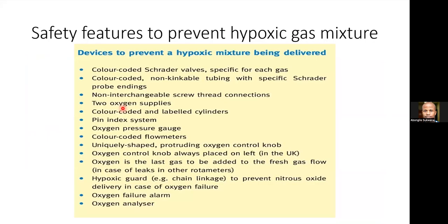Okay, and then these are some of the safety features to prevent giving a hypoxic gas mixture when you're ventilating a patient or when you're using an anesthetic machine. And it's actually a summary of everything that we've talked about. So I won't go through that. I'll just leave the screen there.